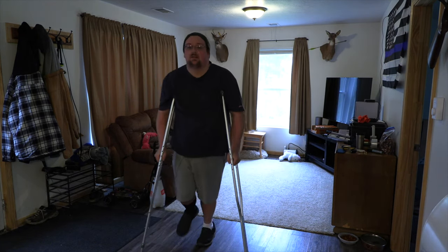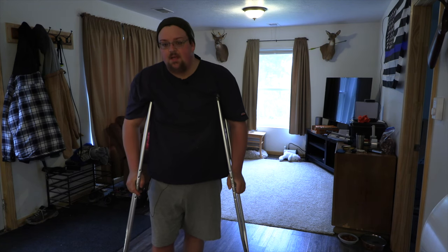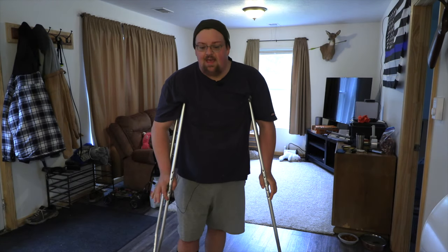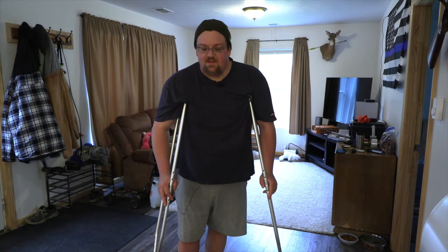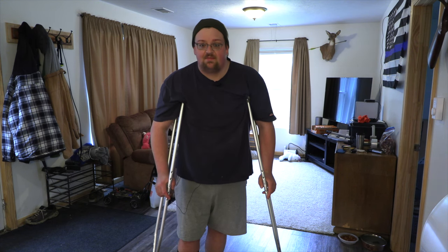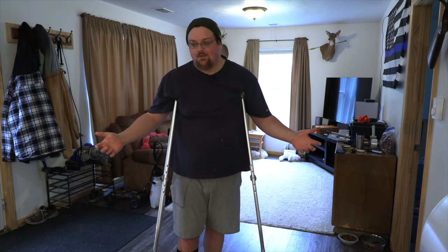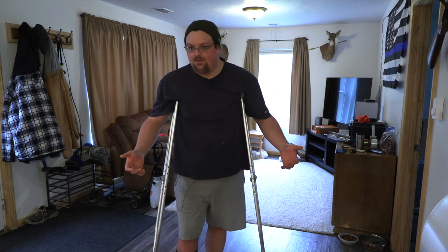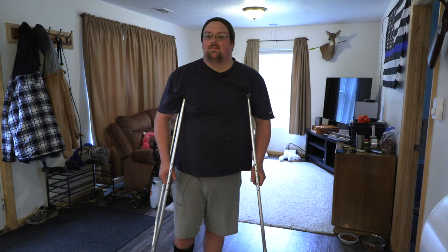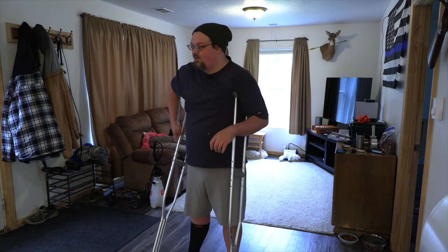I am not a medical professional. I don't know the proper way to teach somebody to walk on crutches, but after almost two months of using crutches, I have gotten pretty good at it. There was a specific way that I used to teach myself how to use crutches and get familiar with them, and that's what I'm going to show you now. Take everything I say with a grain of salt.